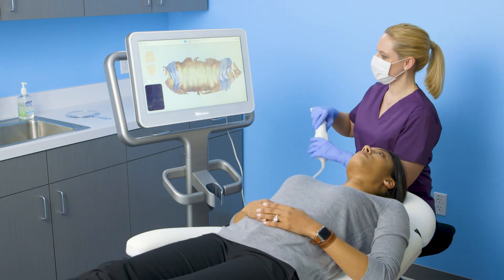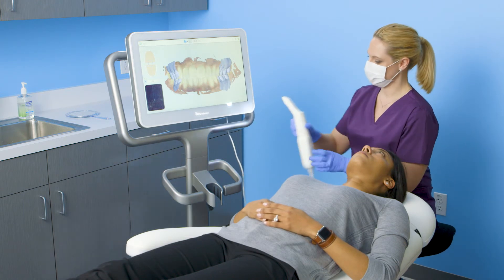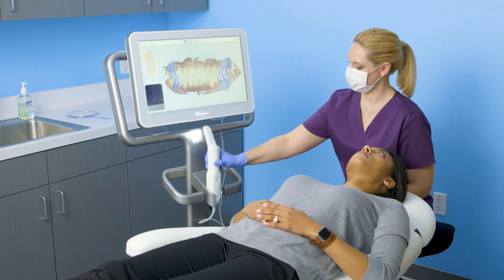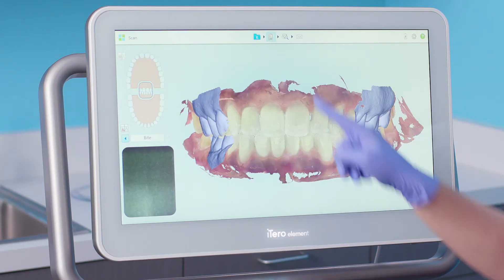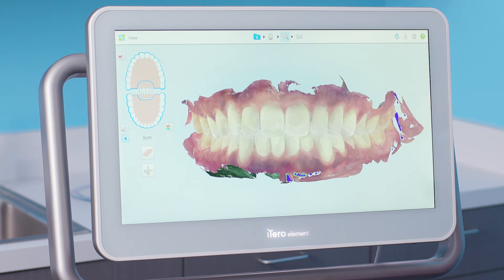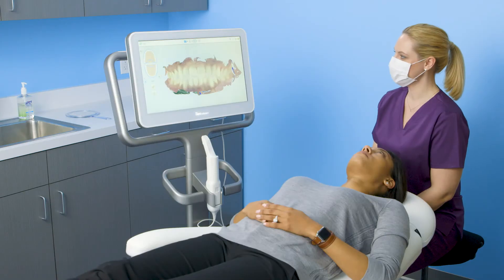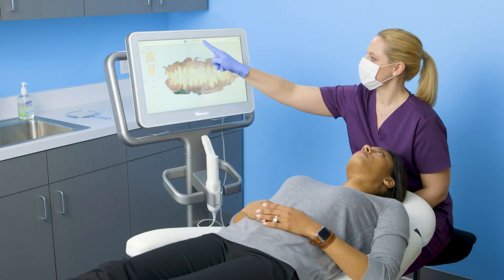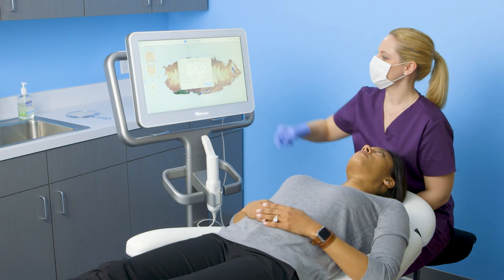When I am finished scanning, I will tap the view icon to view my model in high resolution. When the model is complete, I will tap the envelope icon to send the case.